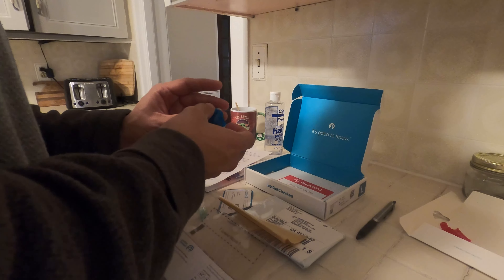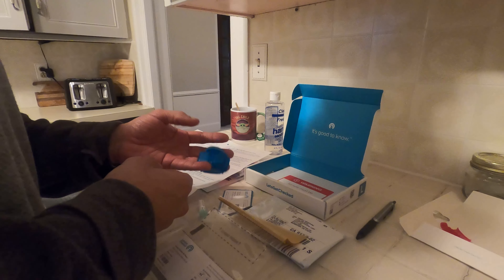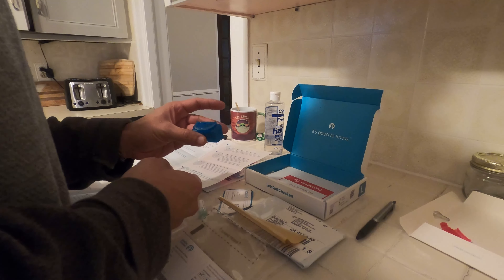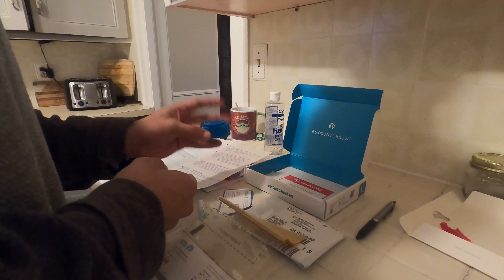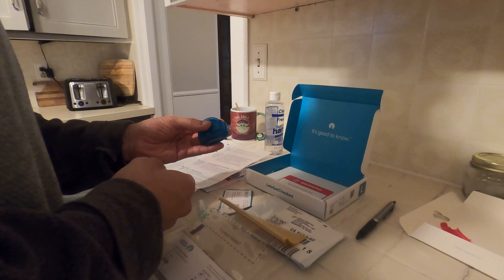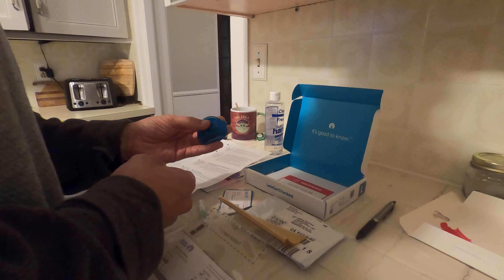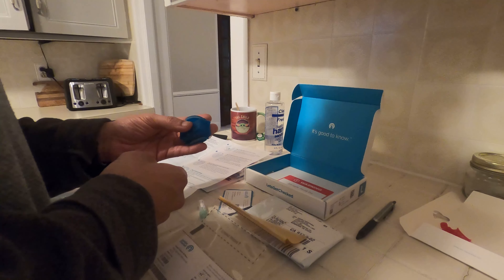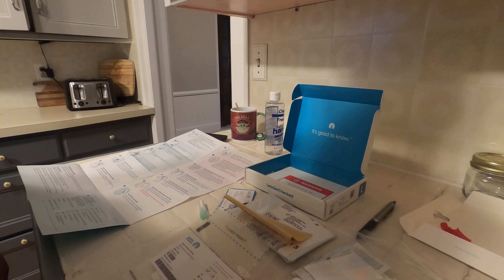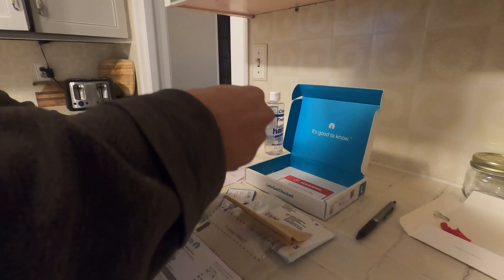Getting this device on was easy to do. What it does is vibrate to concentrate more blood to the top of your finger, so it's easier to take the blood sample — because you do have to prick your finger with one of the lancets and then empty the blood into the small sample tube.